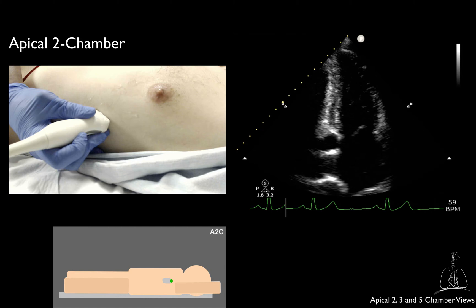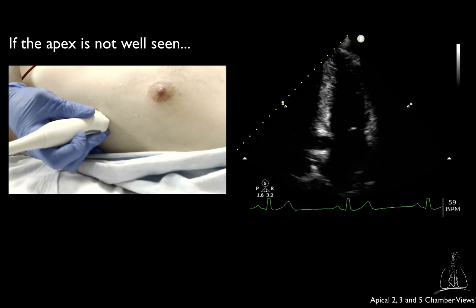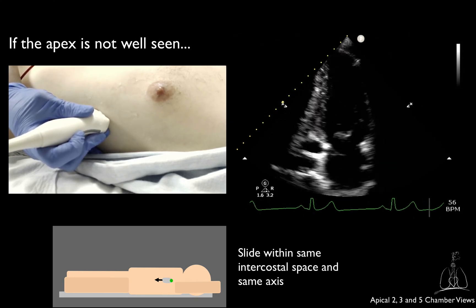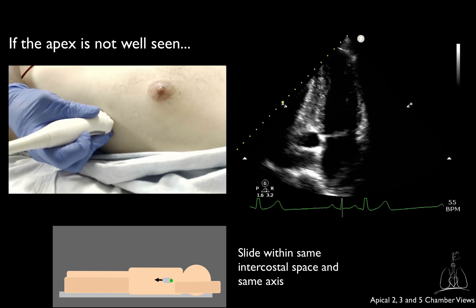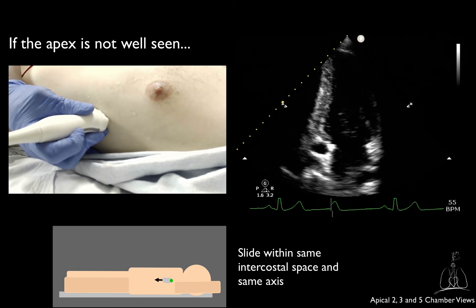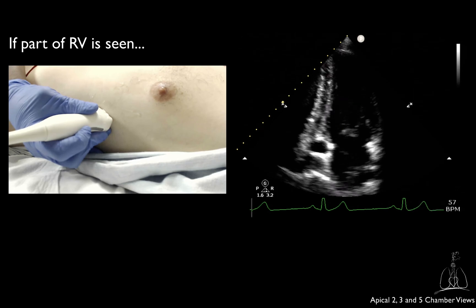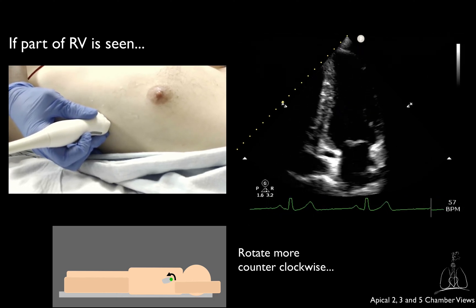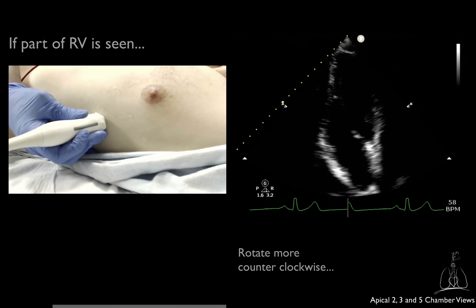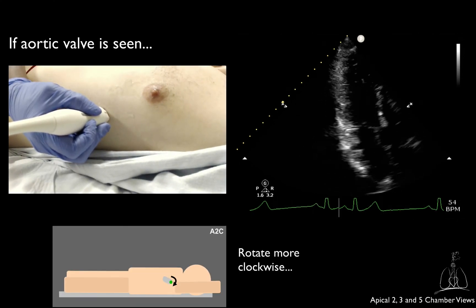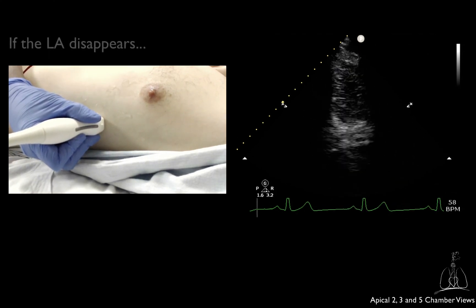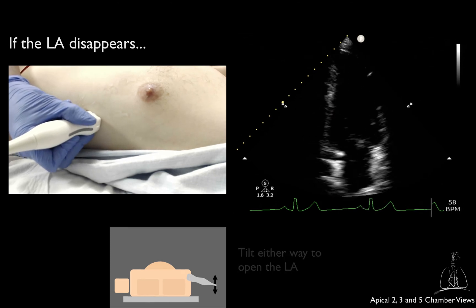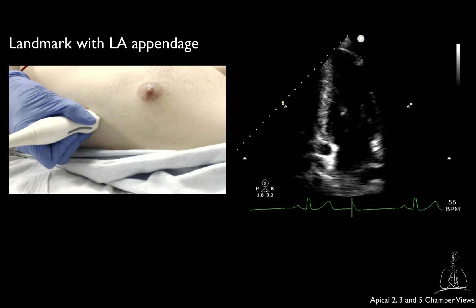The marker should be oriented towards the patient's axilla. If the apex is not well seen, try to slide within the same intercostal space in the same axis. If you see part of the RV, rotate more counterclockwise. If you see the aortic valve, rotate clockwise. If you lose the opening of the atrium, you may have to tilt either way to reopen it. A good landmark to indicate that you have an appropriate view is to visualize the left atrial appendage.